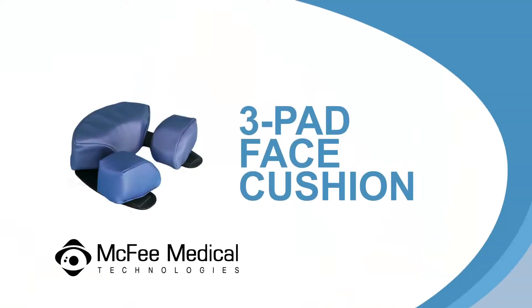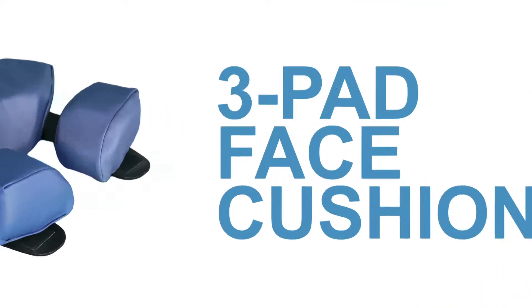The three pad face cushion can be used in place of the crescent face cushion when wearing glasses or an eye patch, and can be used with any of our face down equipment.